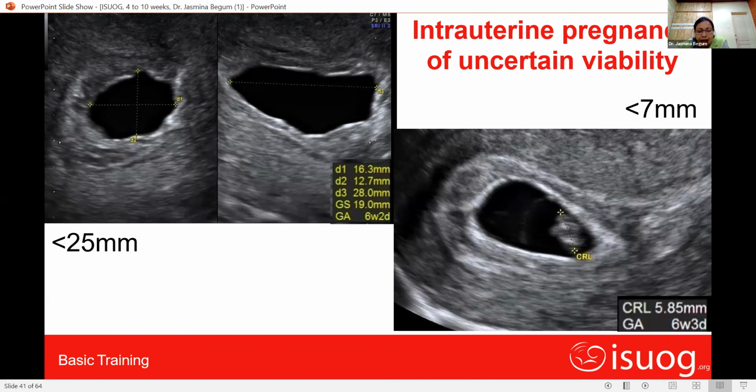It is not diagnostic. It is suggesting that probably the lady will have a miscarriage in future. So call this lady after 7 days, do a scan and see whether cardiac activity is appearing or not. If it is not appearing at your follow-up scan after 7 days, then according to time-based criteria, you can label her as having miscarriage.